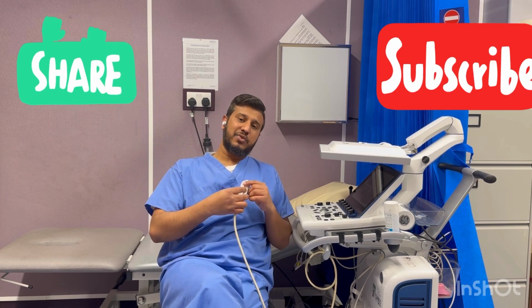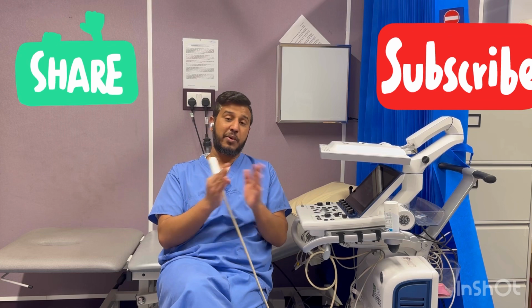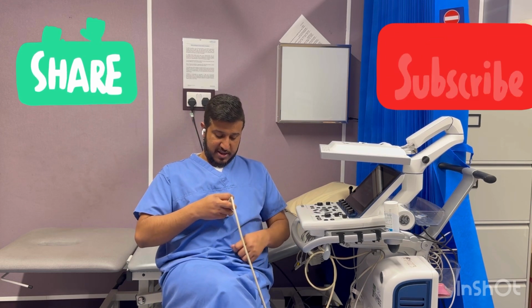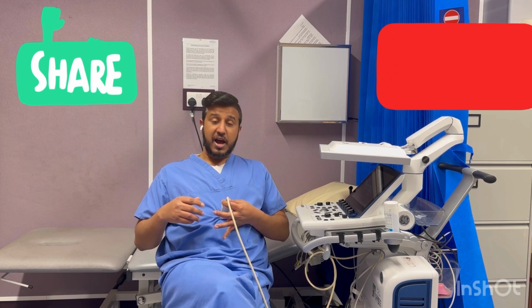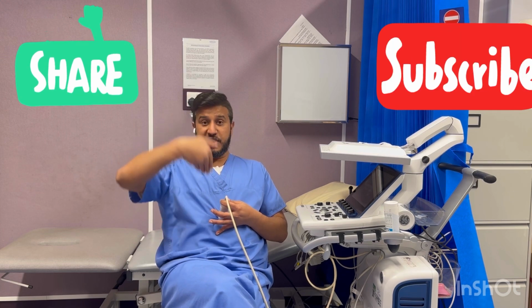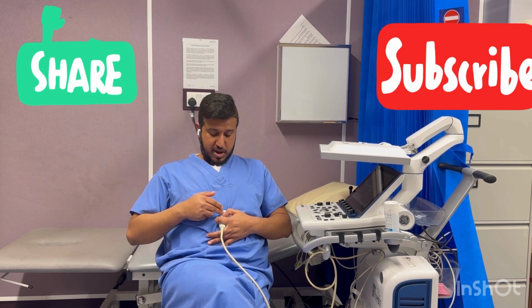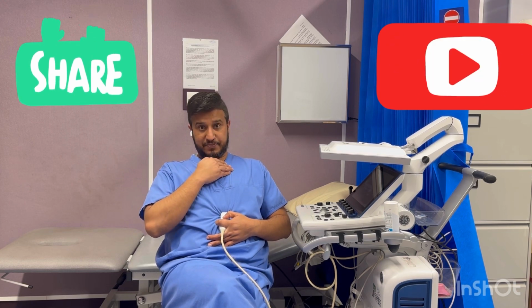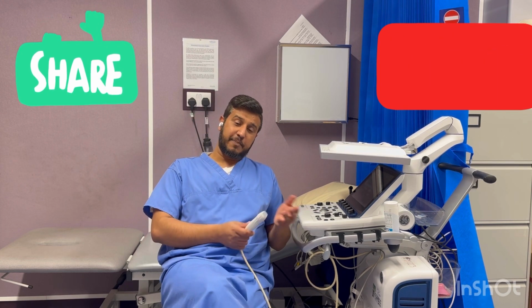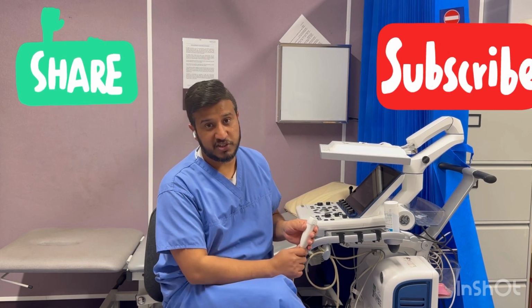Again, the angle is very important. You need to keep this in your mind whatever imaging you are doing: your angle should be towards the heart. If I keep the probe this way, I'm not going to get the images, because my heart is here and I'm sending the waves here. So you need to keep an angle like this to aim towards the heart. You are almost touching, like your fingers will be touching the patient's abdomen, so then you are going to get the best images for subcostal views.